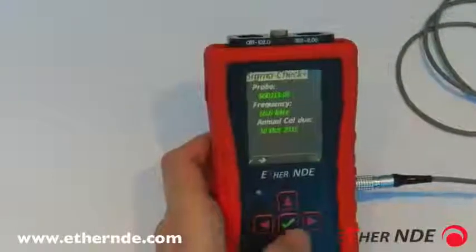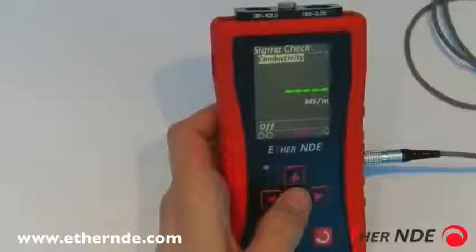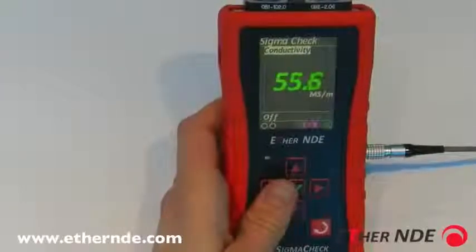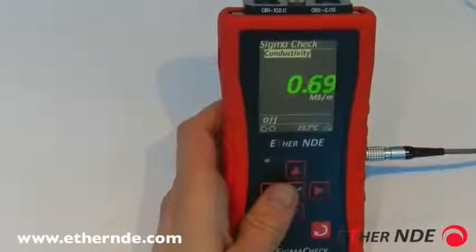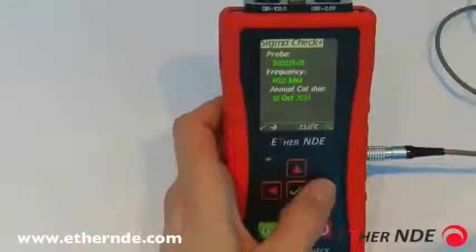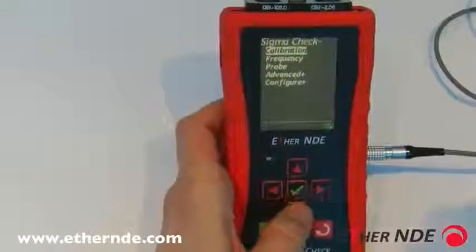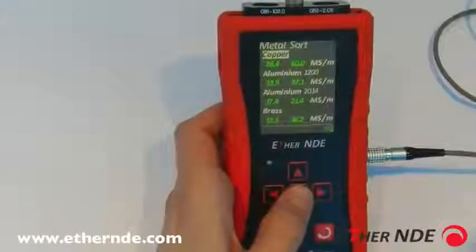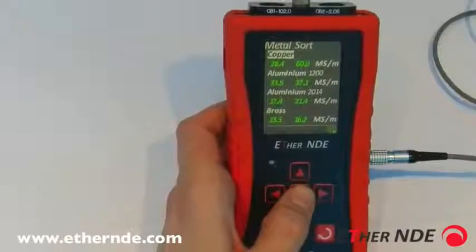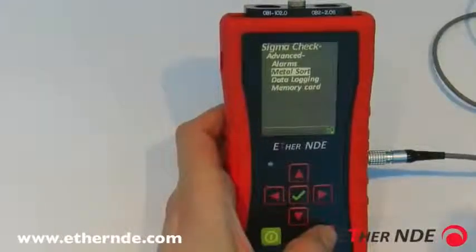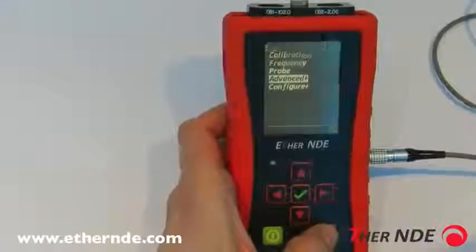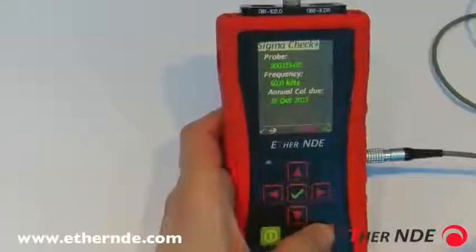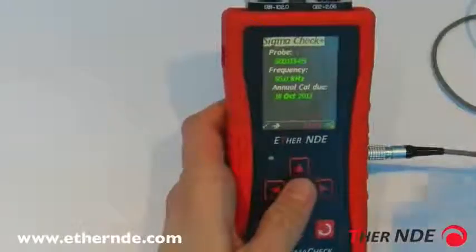To show how the instrument changes, we will change the conductivity from percentage IACS to mega siemens per meter, then tick to confirm. Back on the main reading screen, the conductivity is now displayed in mega siemens per meter. These units are used throughout the instrument — for example, the metal sorting menu now displays all ranges in mega siemens per meter, as before that was in percentage IACS. The same applies when changing temperature and liftoff values.